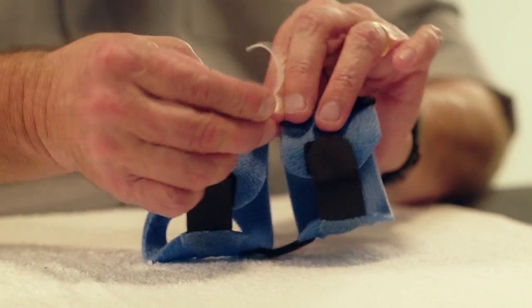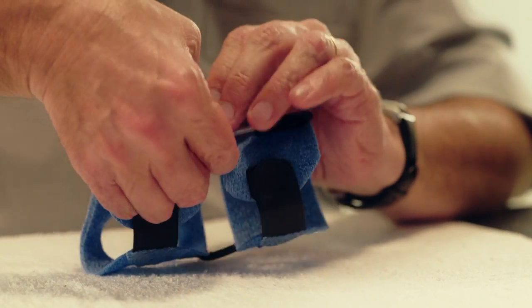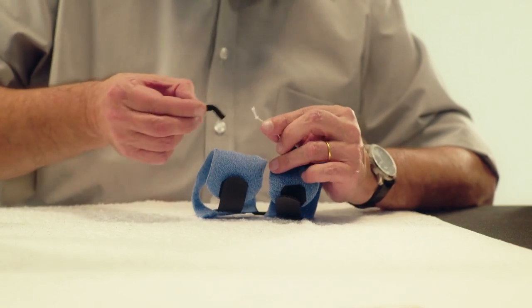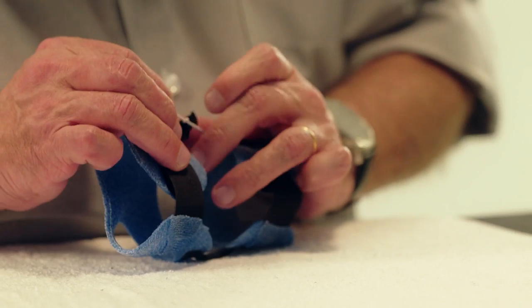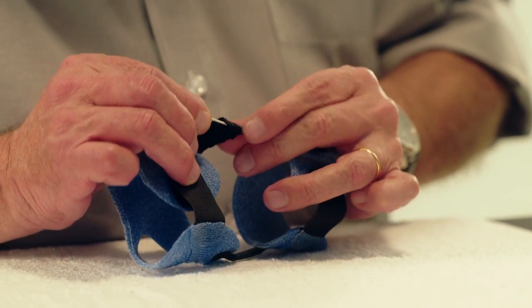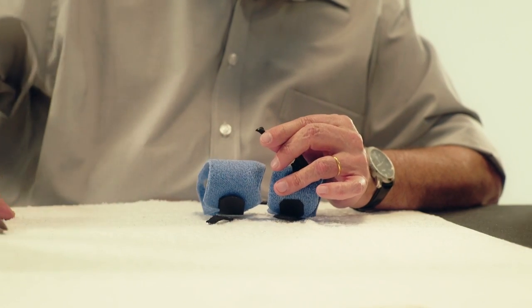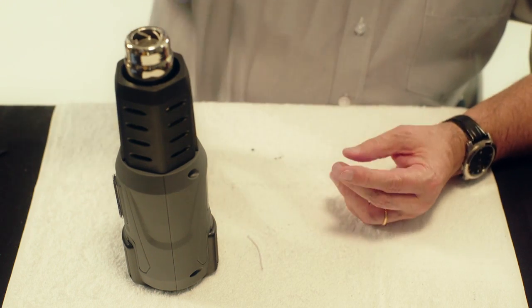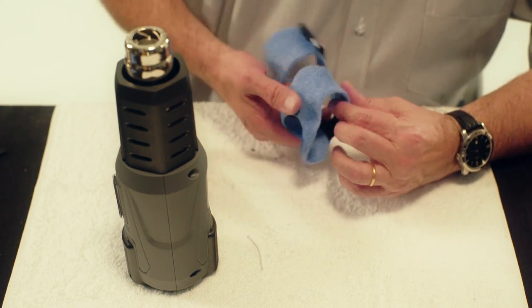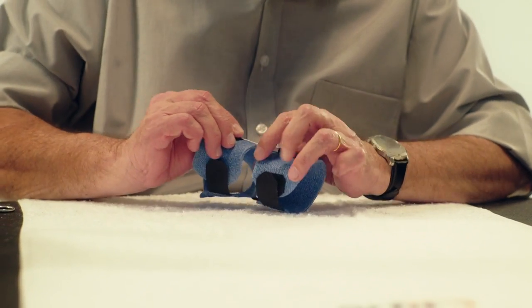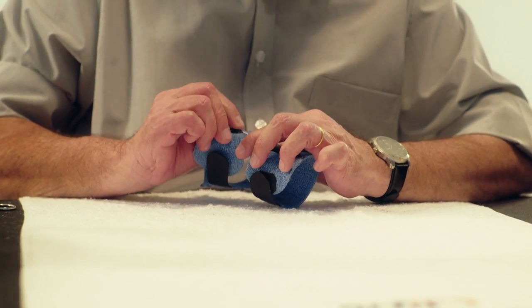Apply tension to the elastic thread and make a knot. Heat a piece of Orphicast with the heat gun and roll this over the knot to secure the knot. Heat the Orphicast protected knot with a heat gun. Stick the knot with sufficient tension onto the distal ulnar part of the orthosis.